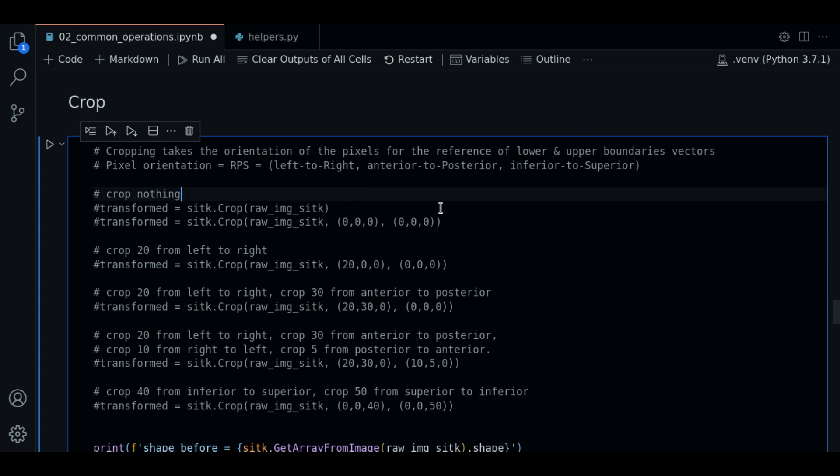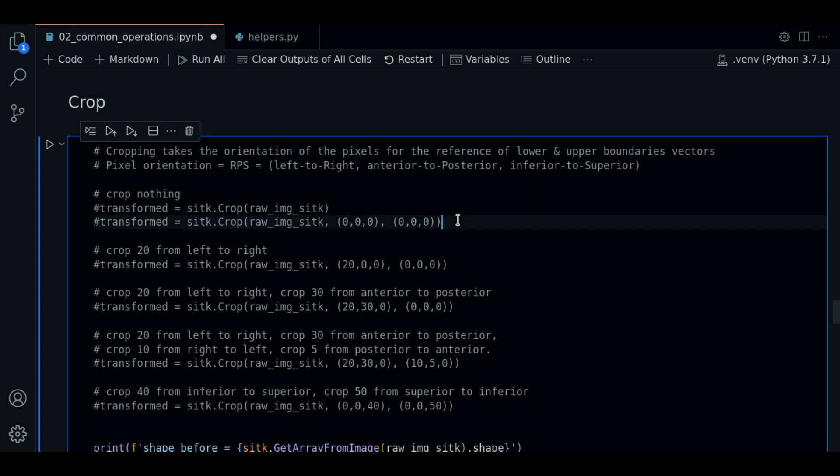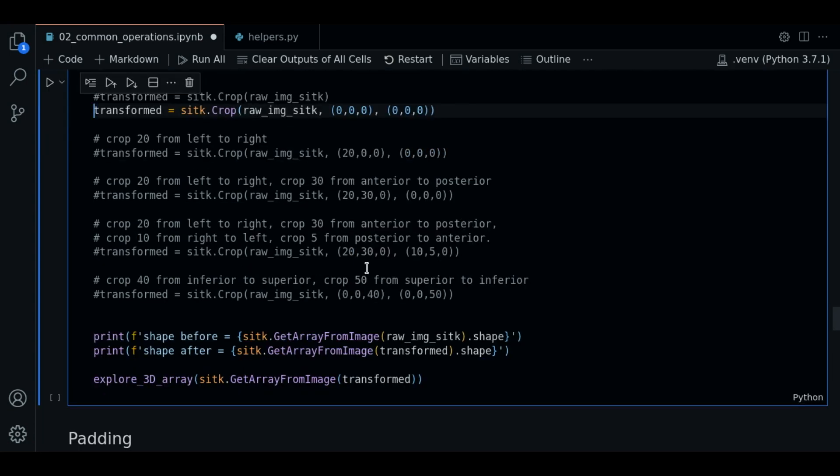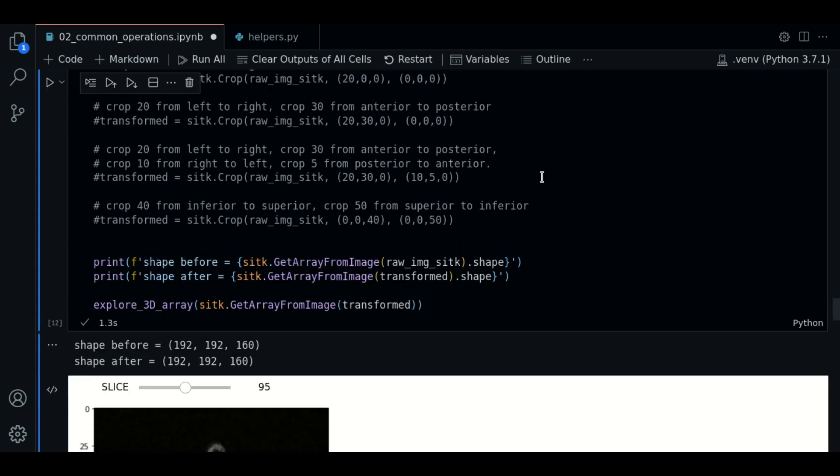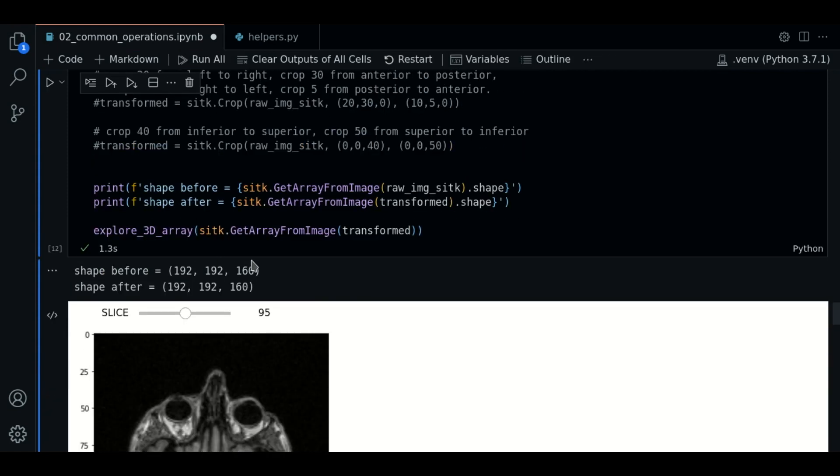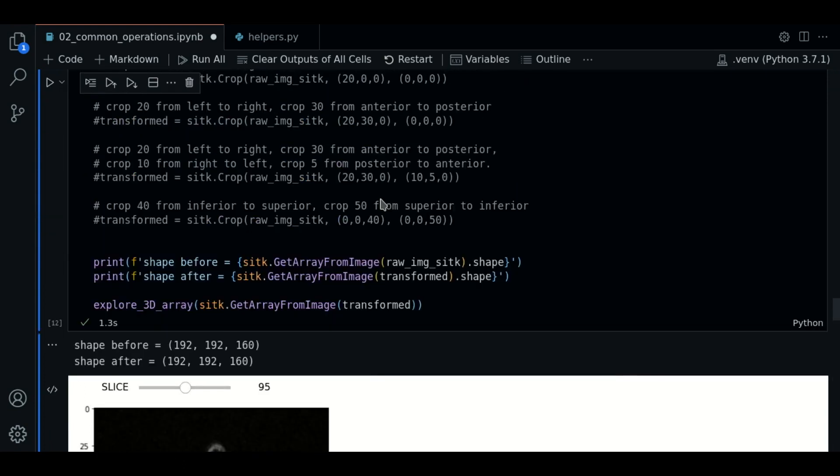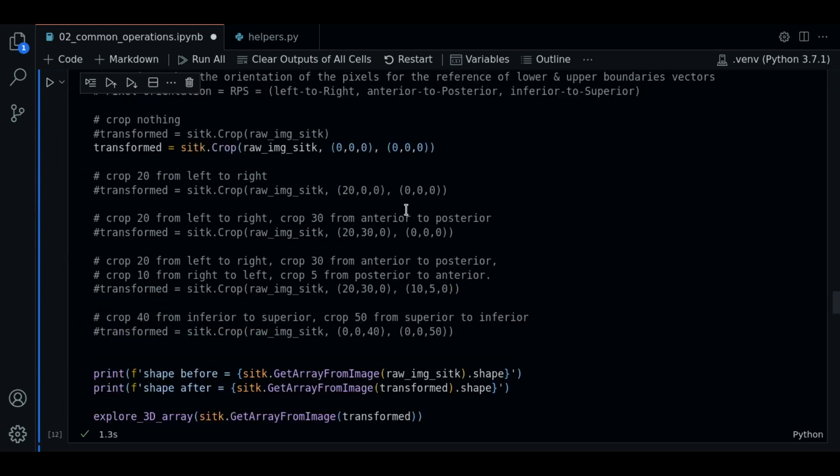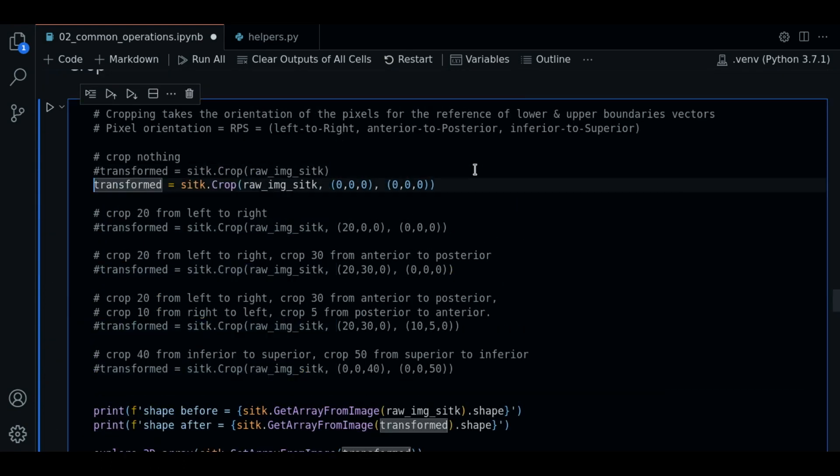We're going to start cropping nothing and then gradually cropping. To do so we call sitk.crop only with the image and calling with zero boundaries. Let's press enter and if we see the shapes, shapes are the same. We are plotting the transformed image but shapes are the same so no difference to see.